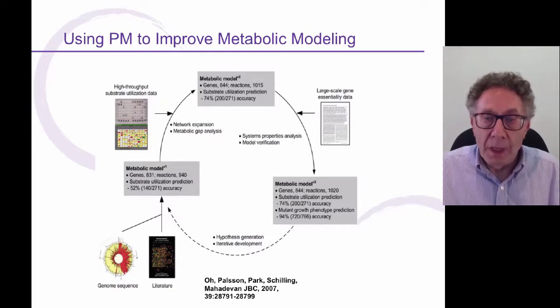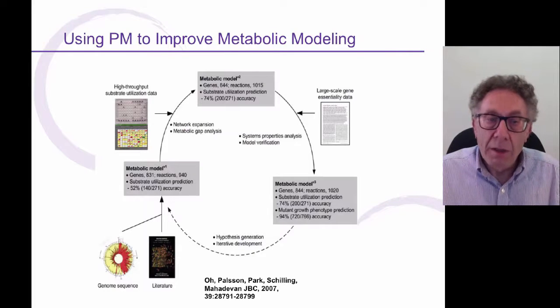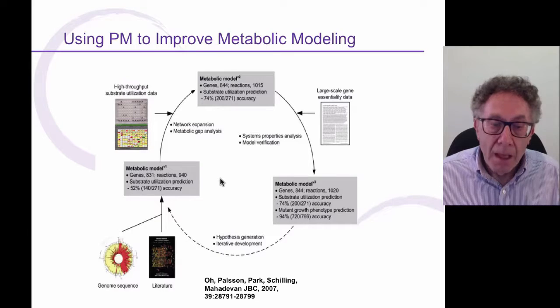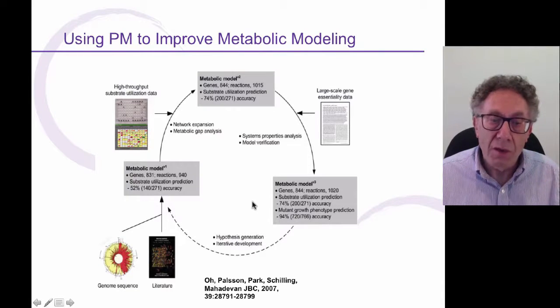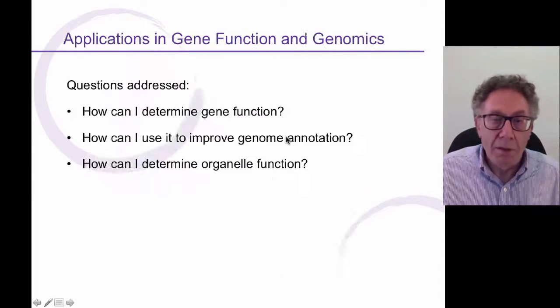And in terms of a lot of metabolic modeling projects going on around the world, Biolog data tends to be used as the truth to compare the predicted models against reality. This is from a paper by Bernhard Palsson's group back in 2007, where they show how they cyclically go around this loop and keep improving their models, improve the predictability, challenge their predictability against Biolog data, Phenotype microarray data, and then again another round of improvement of their model.